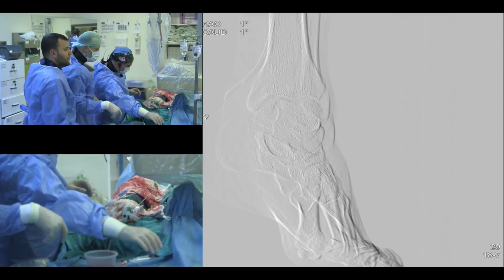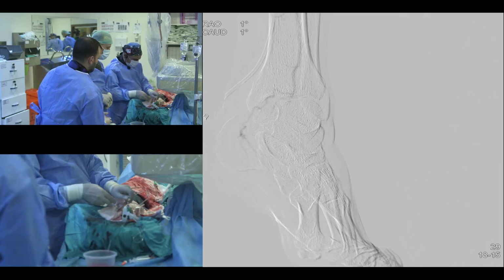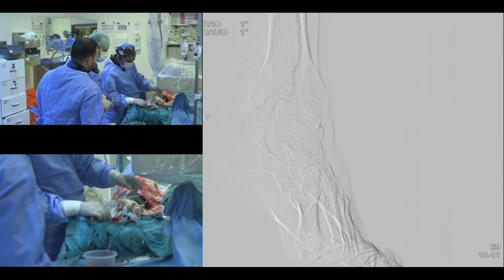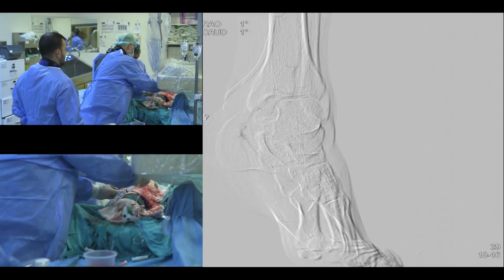And then if you have severe calcification, I would go with, again, a filter. I will use shockwave. You may need to pre-dilate because the shockwave is difficult to deliver if there's heavy calcium. Use a chocolate balloon after the shockwave, then a drug-coated balloon, and you're done with it.